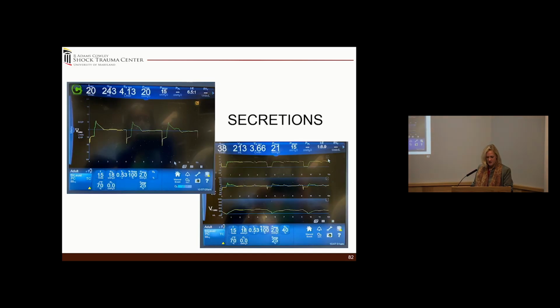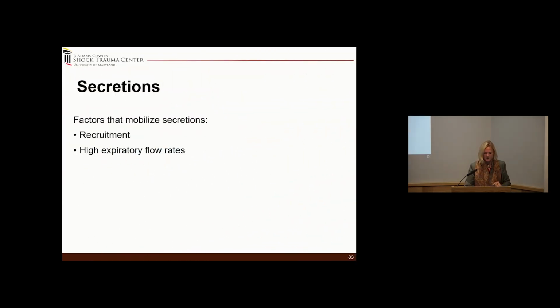This is compliments of Dr. Manugan, who said, I think my patient is, I think it's secretions, and sure enough, suctioned, and this is all it was. Patient was full of secretions. This is the other thing, and I'll actually reserve that because I have some examples.